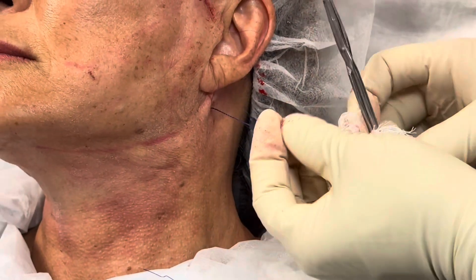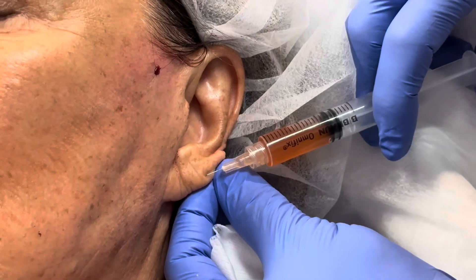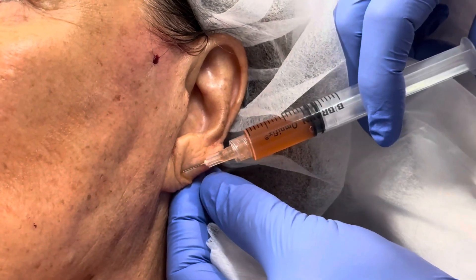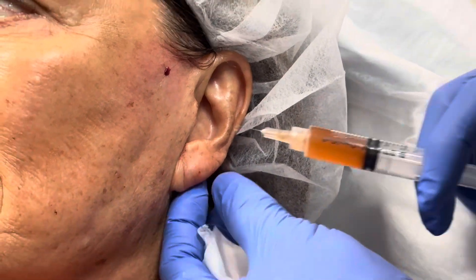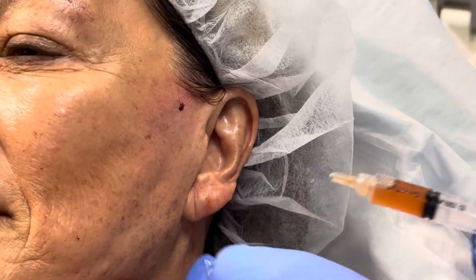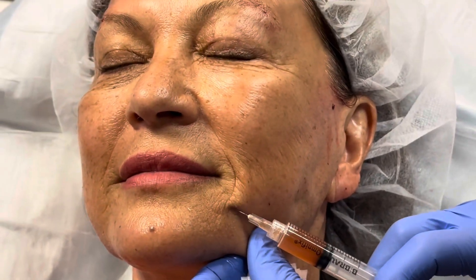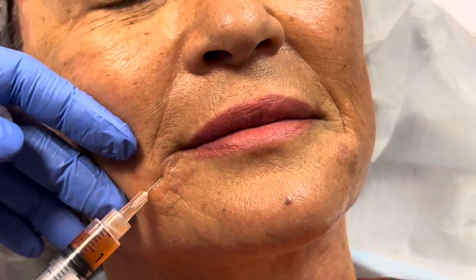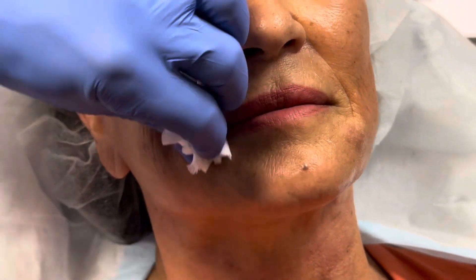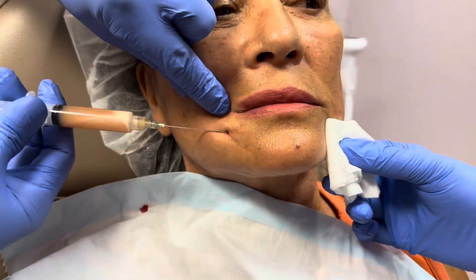That is our PDO thread lift. This next part is optional — it's a bonus. We're injecting PRF into the earlobe to give it a little extra collagen and plumpness. Then we're going to inject PRF strategically in other areas. I like this corner of the mouth where you have some of those folds, and the tear troughs — it's a great area for PRF.